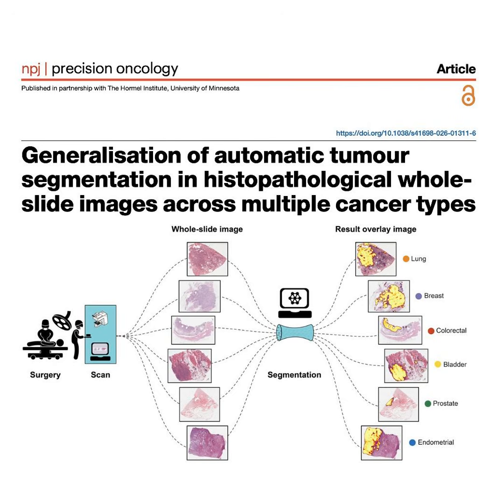So it doesn't just look at a tiny cluster of cells. No, it looks at the broader neighborhood of tissue around those cells to make a much more informed decision. Okay, so the network analyzes every single tile, and then comes the reconstruction phase. The AI scores every tile, and to prevent those ugly artificial seams where the tiles meet, like a bad panorama photo on your phone where someone has two heads. Yeah, we want to avoid that.